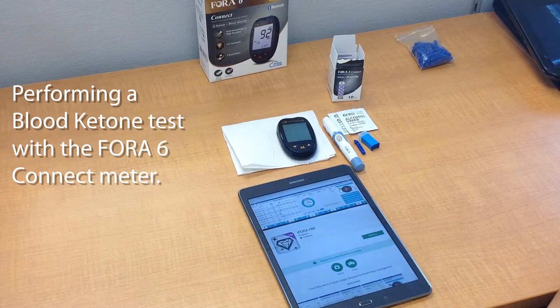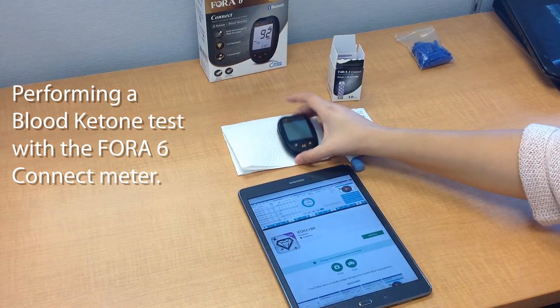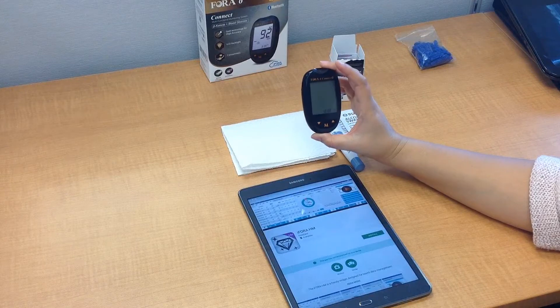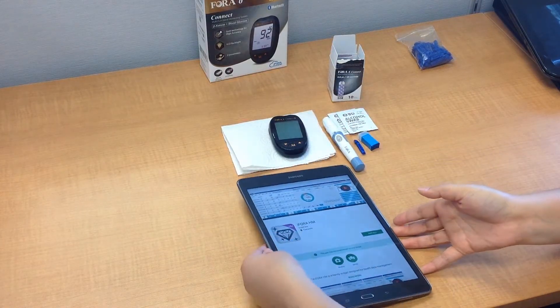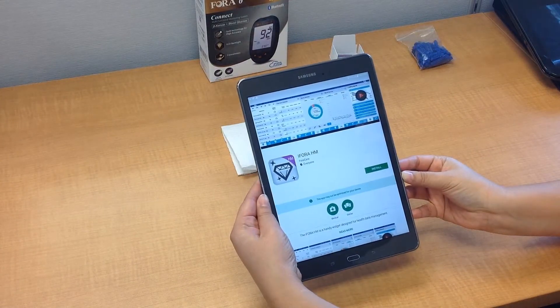Hello! Today we're going to be doing a blood ketone test with the new Fora 6 Connect blood glucose and blood ketone meter. We're also going to be pairing it and uploading our results to the new iFora HM app.